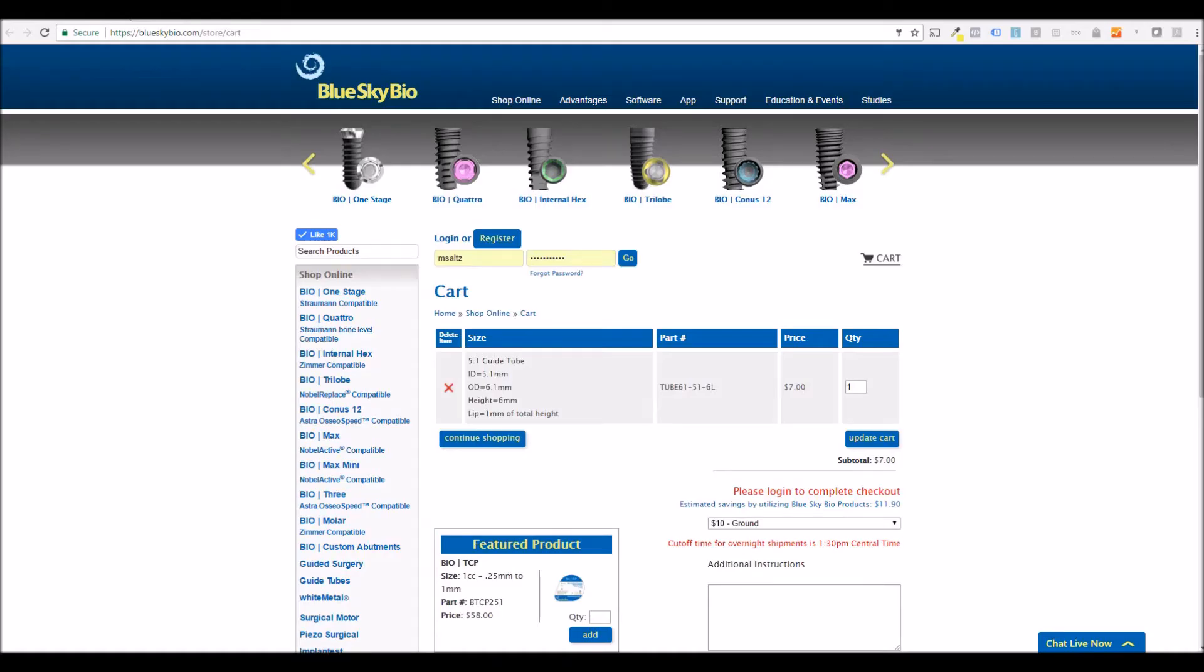At the end of the wizard process, the BlueSkyBio website will open with the relevant metal cylinder added to the shopping cart based on the guided surgical kit and implant selected.